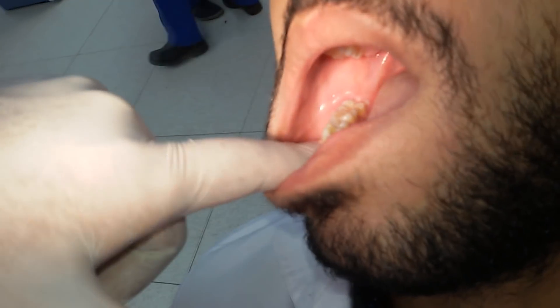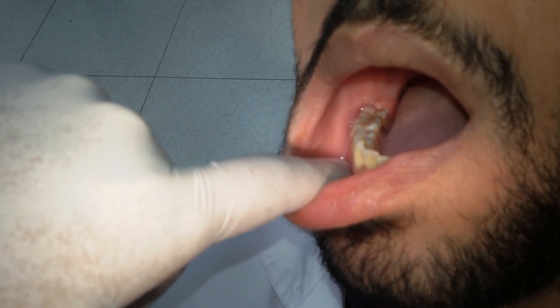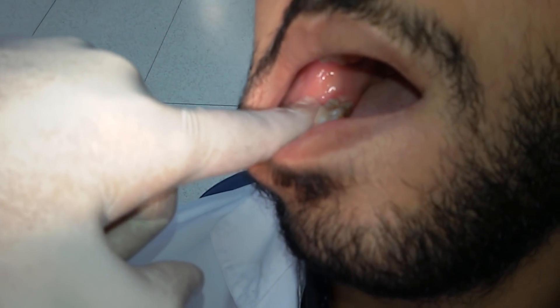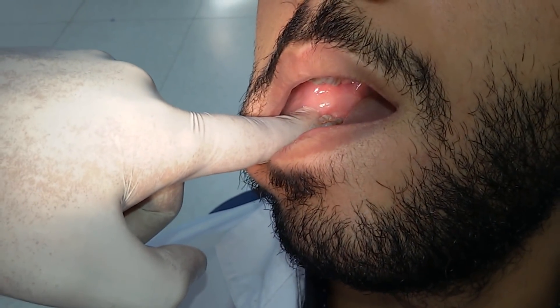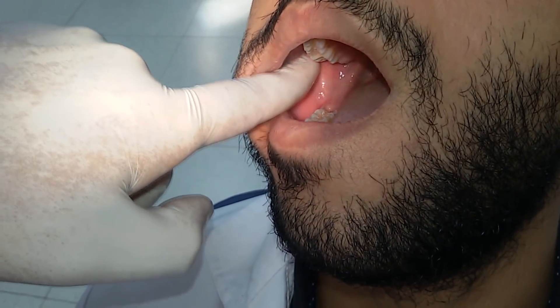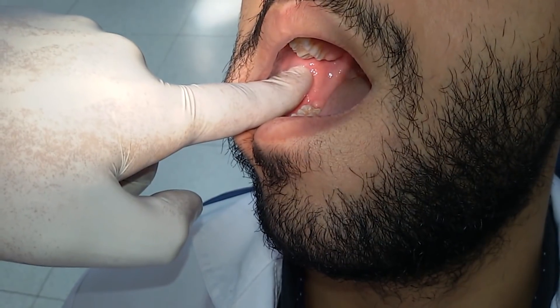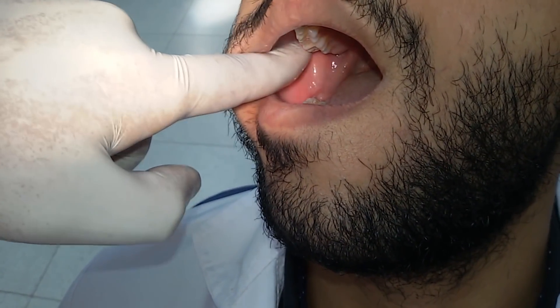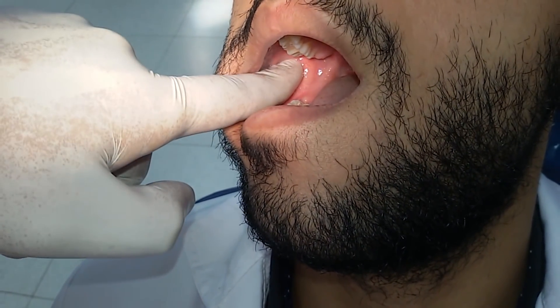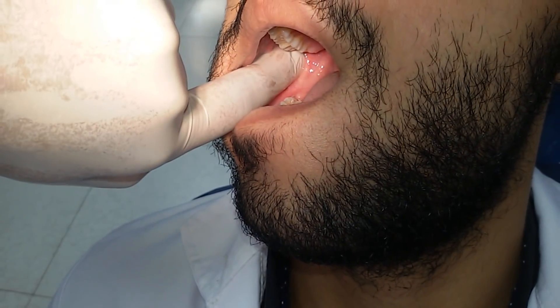Place your index finger of the non-dominant hand in the mucobuccal fold opposing the lower premolars, with your fingernail facing upwards and parallel to the occlusal plane. Move your finger posteriorly until you feel the external oblique ridge, then trace it posteriorly and superiorly until you reach the most concave area, which is the coronoid notch. To make sure you are in the most concave area, trace the bone more superiorly — you will feel convexity. When you feel convexity, you are out of the coronoid notch, so go back to the most concave area. Only at this point, turn your finger so that your fingernail faces medially, retract the tissues, and fix your finger.